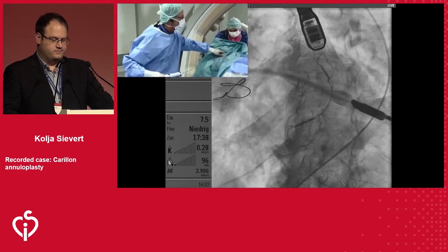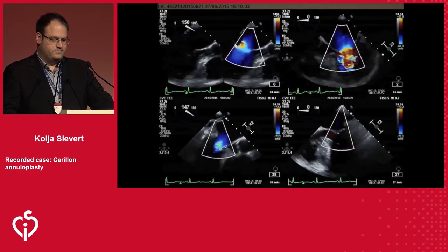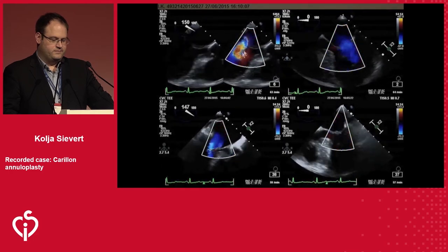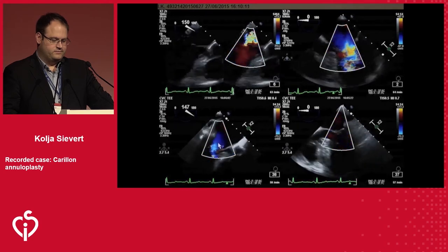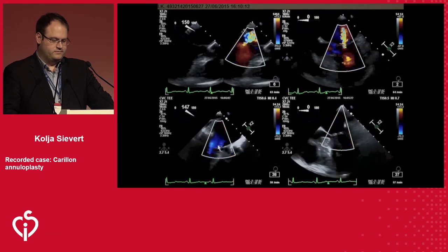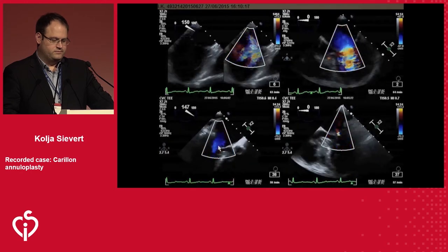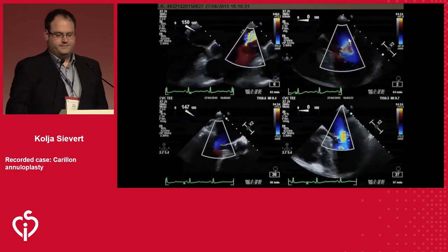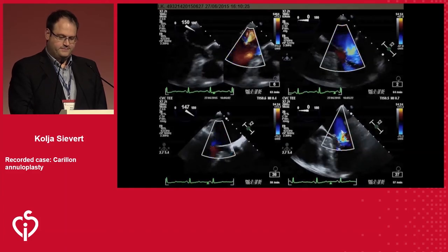Okay, so now Ilona will check for the echo images. You see here the long axis. Before the procedure, you see the moderate MR. And here, you see MR after the procedure with the fantastic result. So on this side, you see 0 degrees before the procedure, after the procedure.